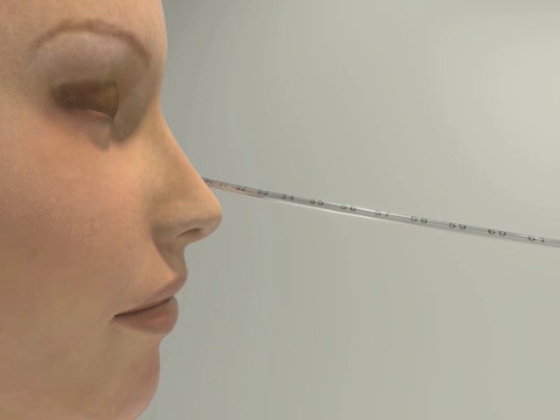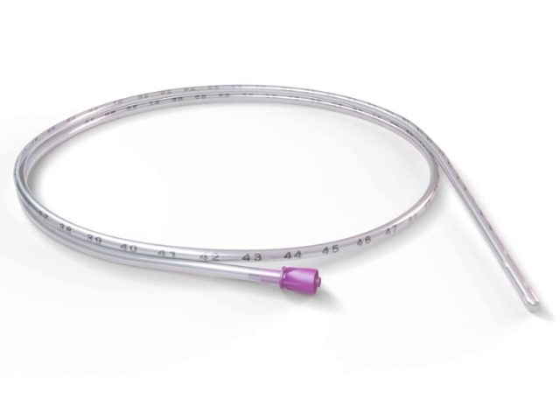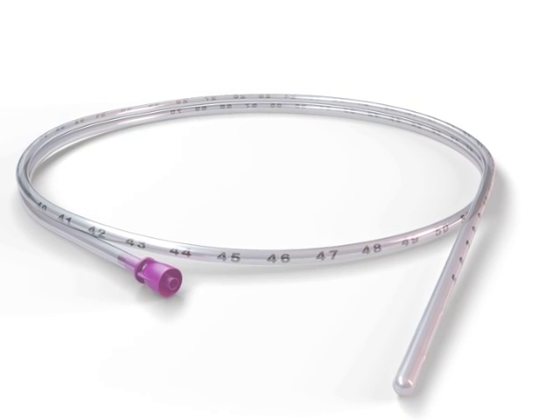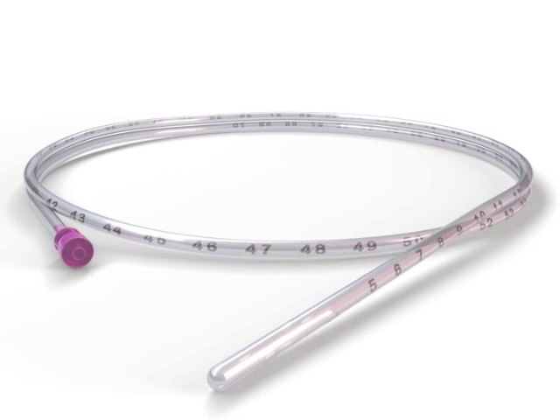Document the first visible measurement mark at the tip of the nose in order to detect any future tube displacement. If appropriate, hand the patient a glass of water. Lubricate the tube with gel.